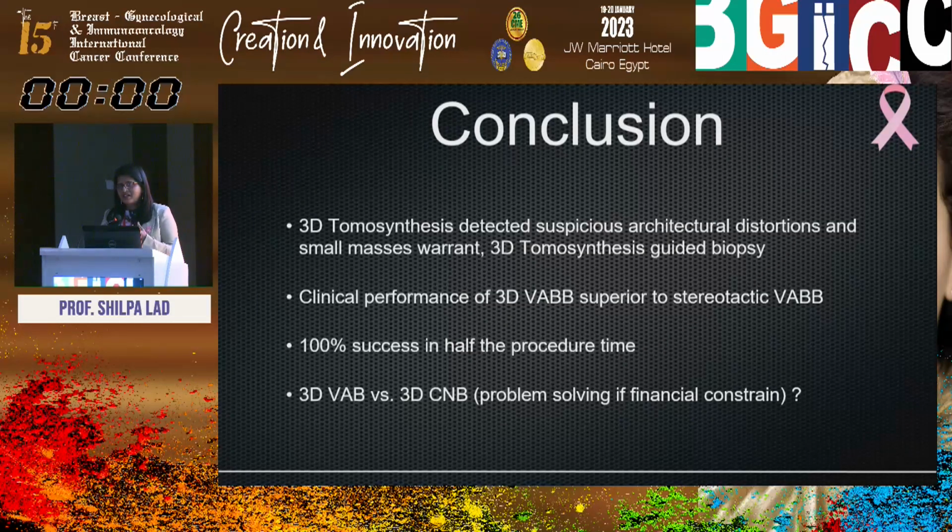But in countries where we still struggle with economics in medicine, we really have to continuously improvise and problem solve, and therefore the attempt to do core biopsies. And so far our results have been good, even with core biopsies, 12-gauge needles. I wonder if you guys have some similar experiences to share. And I'm happy to take any questions regarding the procedure, if there are any.